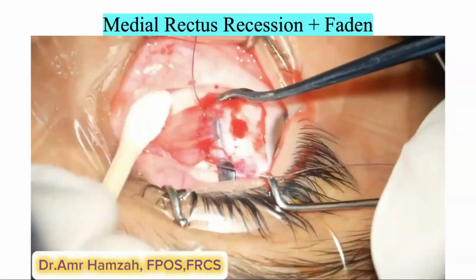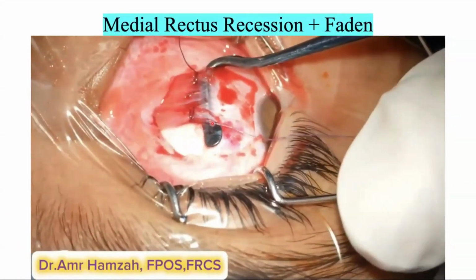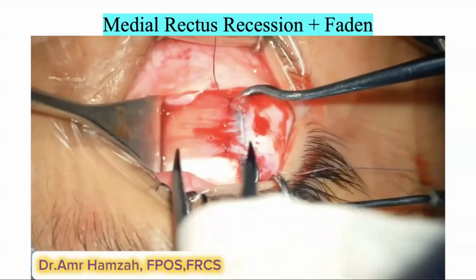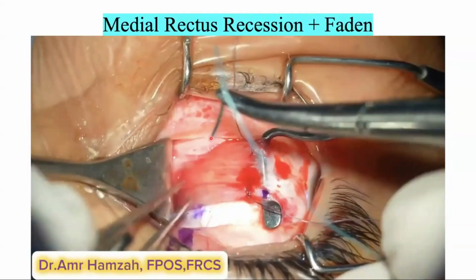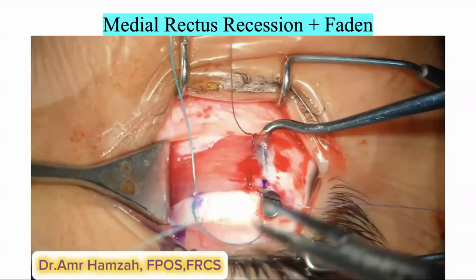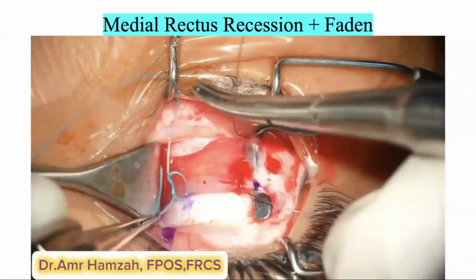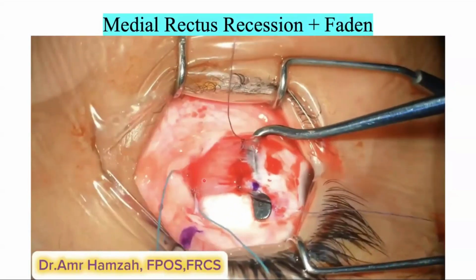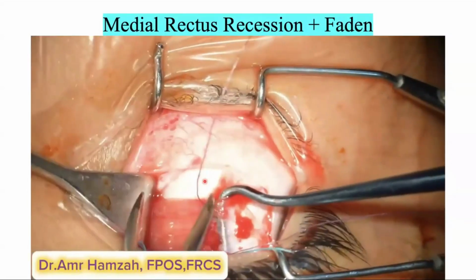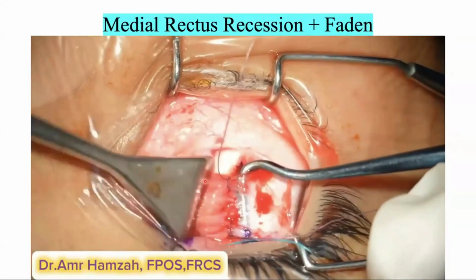Here I'm isolating the medial rectus muscle using 6-0 Vicryl suture, and I'm planning to do a 6 millimeter recession. I measured 8 millimeters from the medial rectus insertion and put 5-0 Ethibond non-absorbable sutures on either side of the muscle.